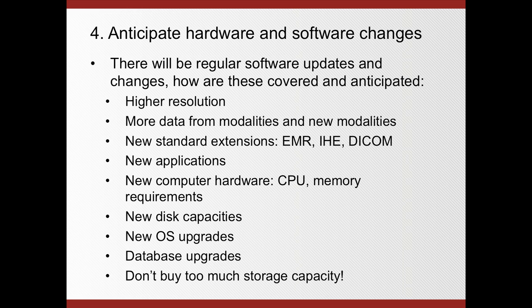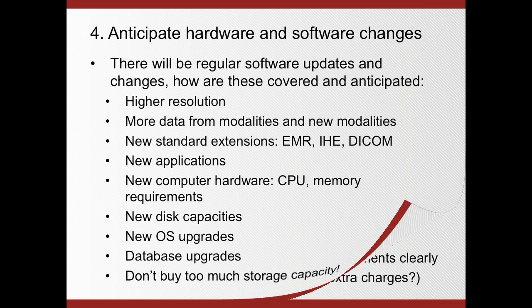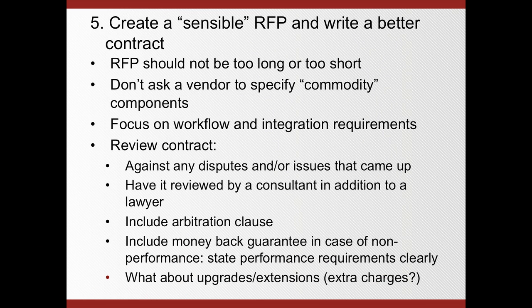Plan ahead, and let's say maybe you buy for 1 or 2 years ahead, and then plan at that time to look at your storage capacity and buy the latest and greatest higher density disks, and that I'm sure will be less expensive.